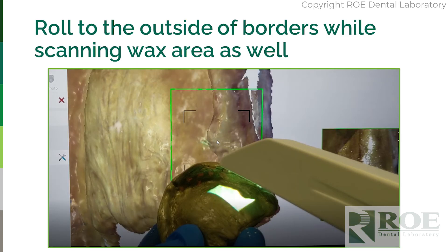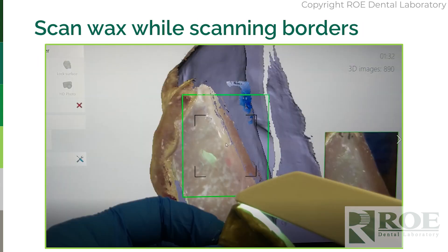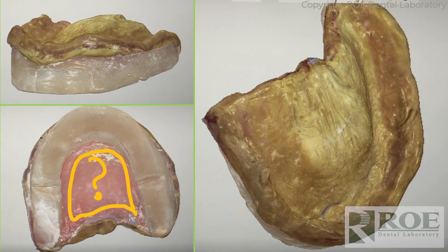Scan all the way around, scan the full border, and then start to roll towards the facial. Again, scan the border and the wax at the same time to capture the full roundness of the wax. Scan all the way around, and then roll over to the occlusion. Some scanners at this point will run out of memory — you do not need to scan the tongue part of the palate; it's not needed. We captured the intaglio and will make a simple calculation to figure out the thickness of the material. Scan the full occlusion and be sure you've scanned the posterior distal area of the denture.